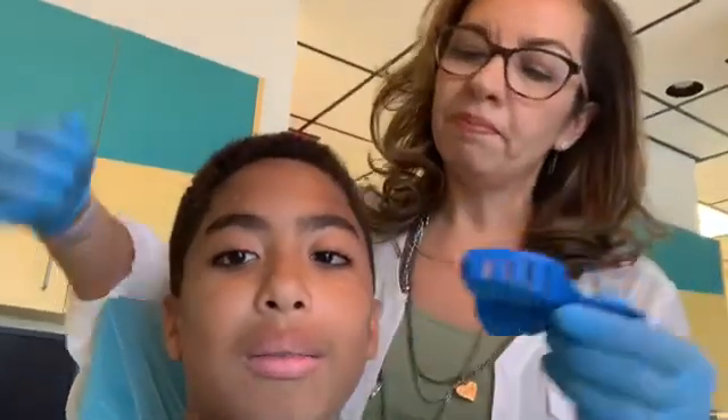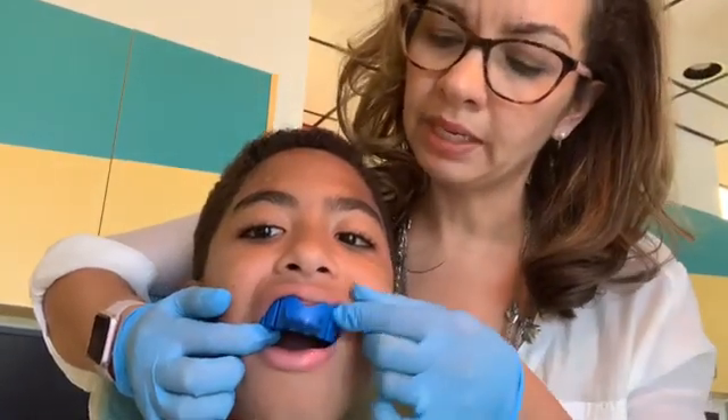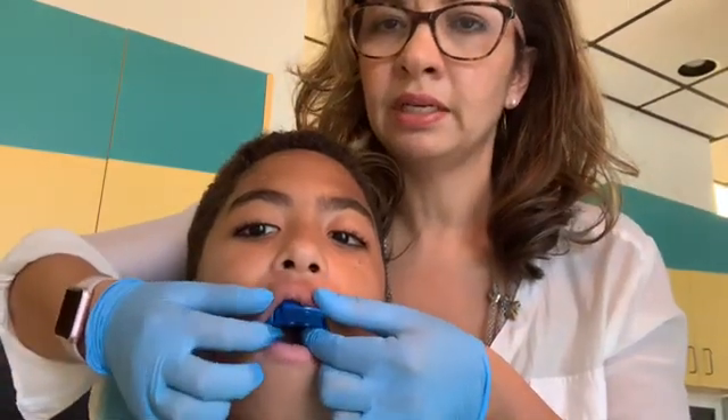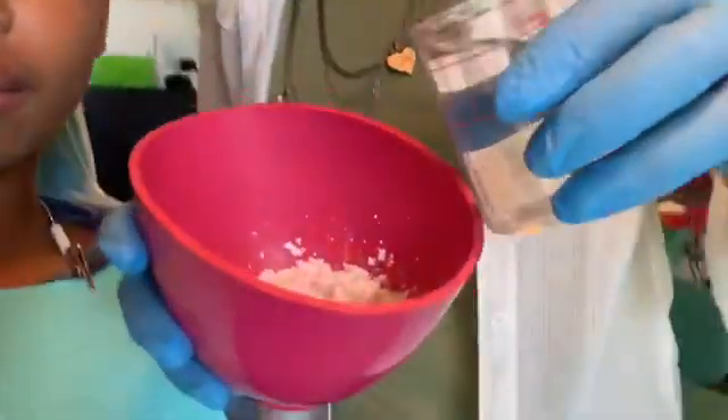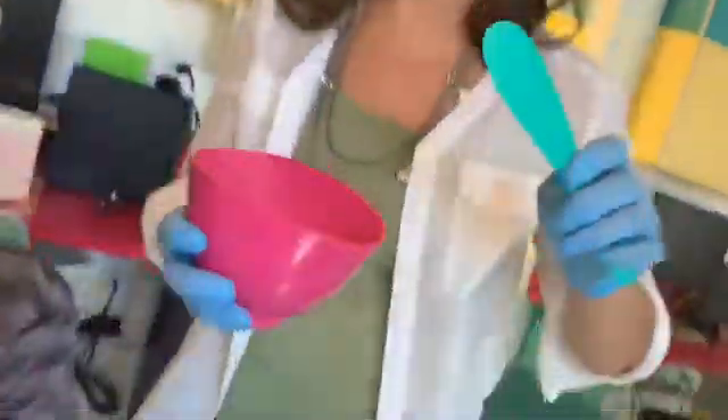All right, let's try on this tray — it's going to go in just like this, on the side and up, all the way to the top, because we want to get all the impression material up under the lip to get a good mold. So let's see how we mix it up — we have a powder and water, and we're going to mix it up. This is a color-changing indicating alginate material, so you can see it's kind of a lilac color, and we have about 35 seconds to get it all mixed up.